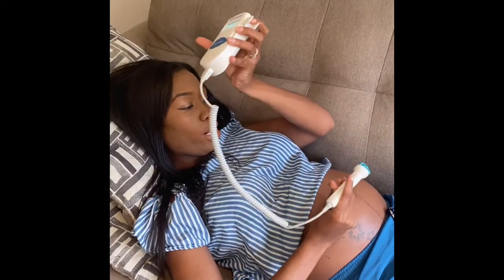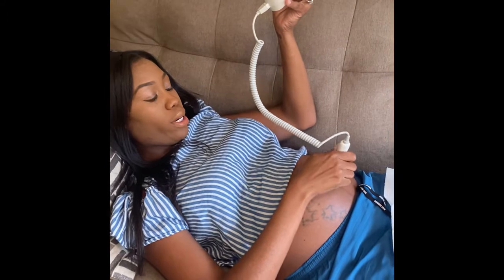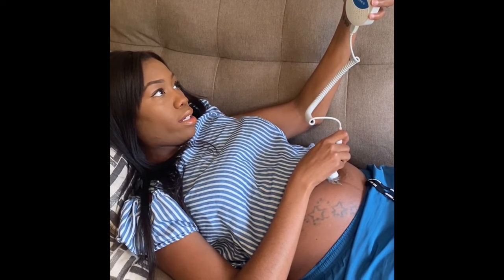So let's see if I can find the little baby. I'll start in the middle. And don't be scared to apply a little pressure. Nothing with pain or discomfort, but a little pressure is fine. So let's see if I can get a better read on that. Now, because I'm bigger, he's so active that sometimes it's really hard. And there it is, kind of. I slowly move it over because I can vaguely hear it, but I really want to get a clear one to show you what it looks like. And there he is.